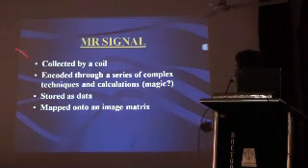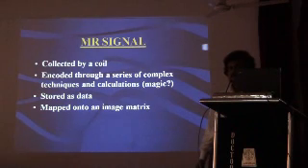Now, the MR signal is basically collected by the coil, encoded through a series of complex techniques and calculations, almost what we call magic, stored as data and mapped onto an image matrix.